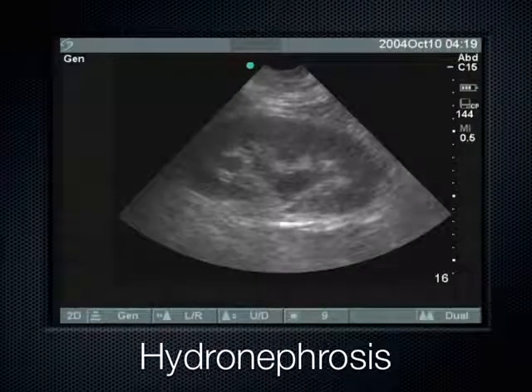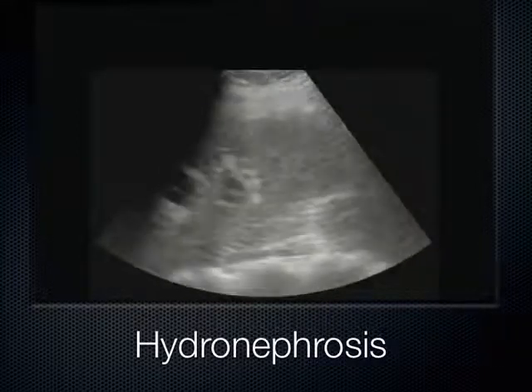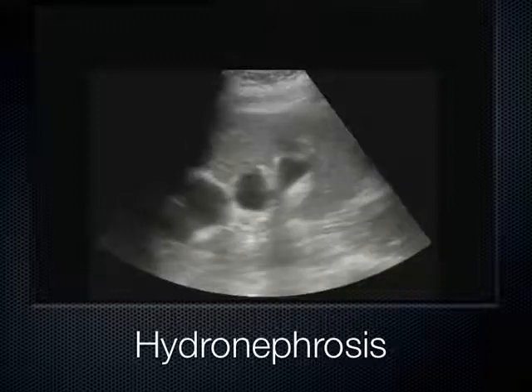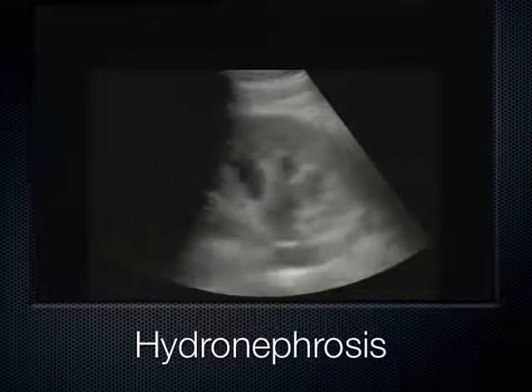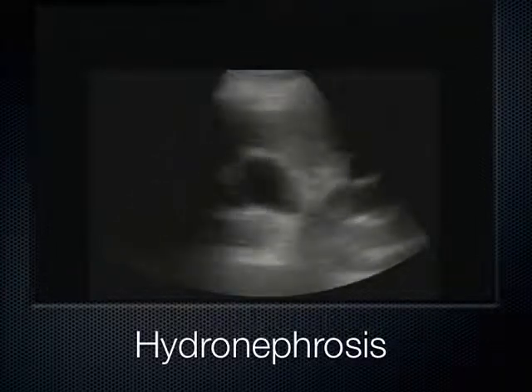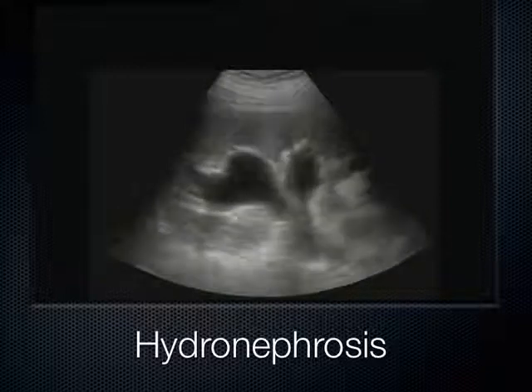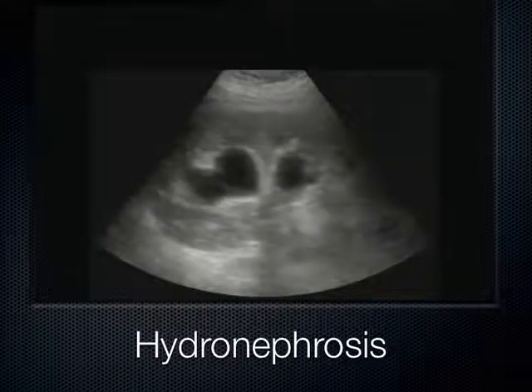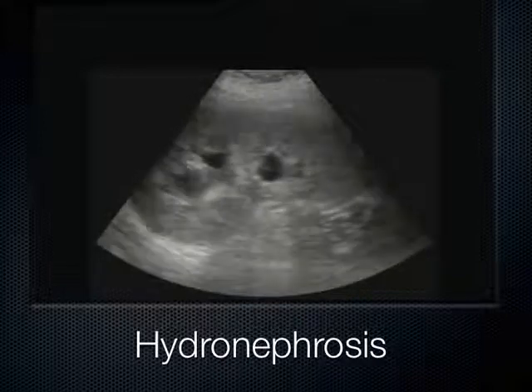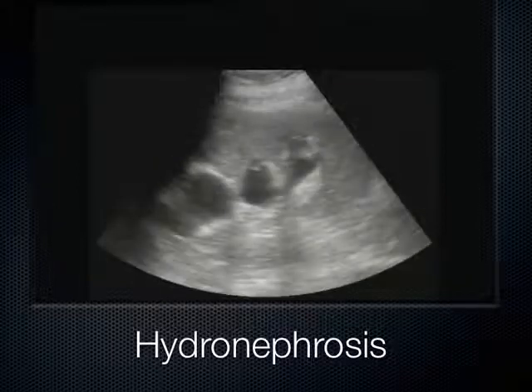Moving further, we can see those fingers of the glove going out into different projections — they eventually coalesce right at the renal sinus. That's another bit of mild hydronephrosis. It's a nebulous grading category. Here it's splaying out — still mild — and we can still make out plenty of cortex around the kidney.